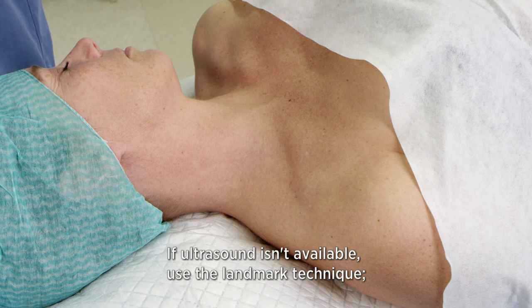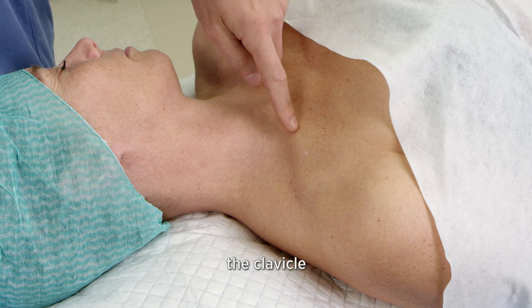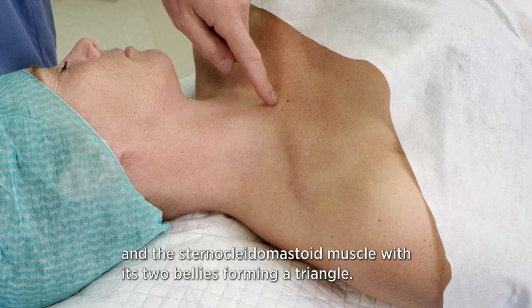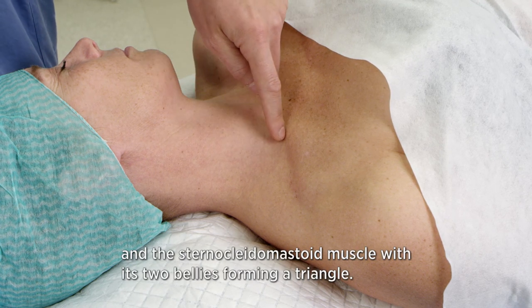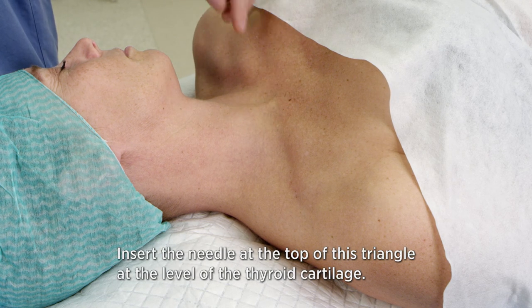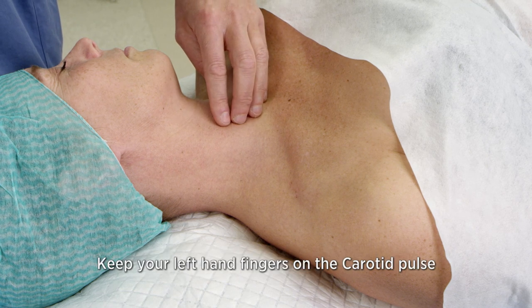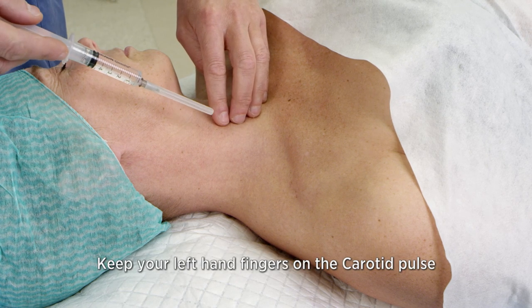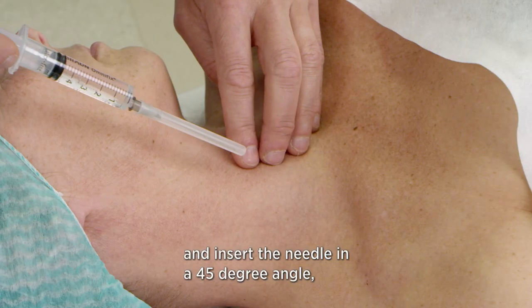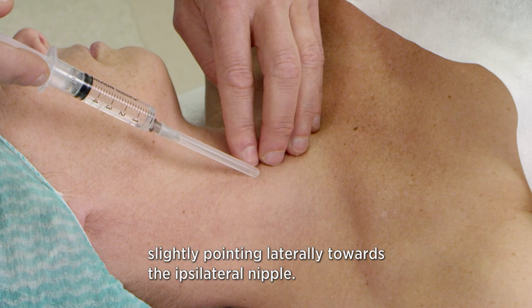If ultrasound isn't available, use the landmark technique, identifying the jugulum, the clavicle, and the sternocleidomastoid muscle with its two bellies forming a triangle. Insert the needle at the top of this triangle at the level of the thyroid cartilage. Keep your left hand fingers on the carotid pulse and insert the needle at a 45 degree angle slightly pointing laterally towards the ipsilateral nipple.